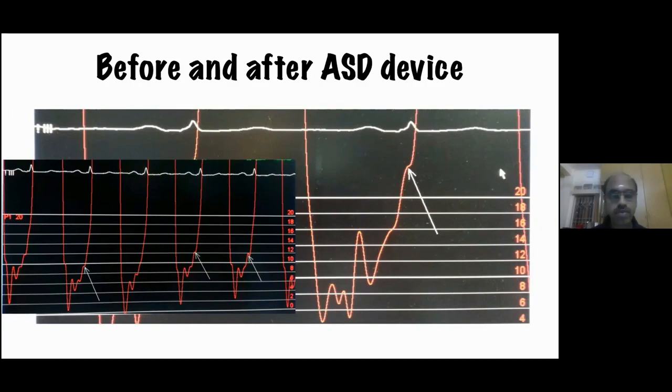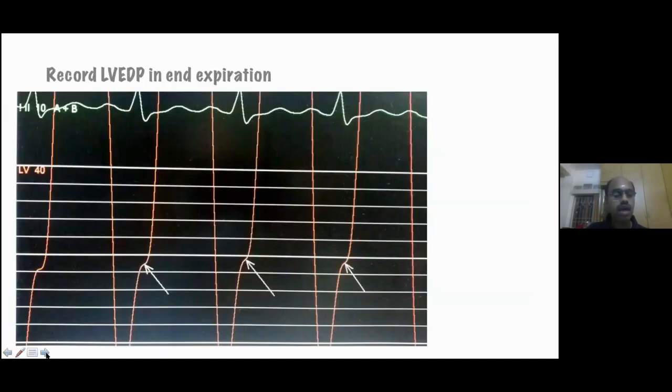Dear friends, it's with great pleasure that we are commencing today our second session on the same topic, catheter hemodynamics. We came up to ventricle and ventricular end diastolic pressures. We entered into pulmonary artery and then the time got over. So we are going to start with pulmonary arteries, but since in today's chat box there are two questions on ventricular end diastolic pressure, we are just going to refresh only that point.